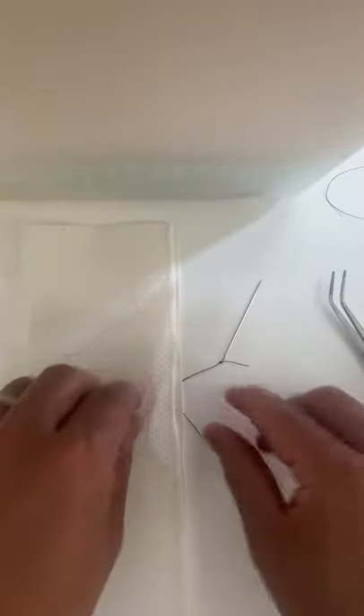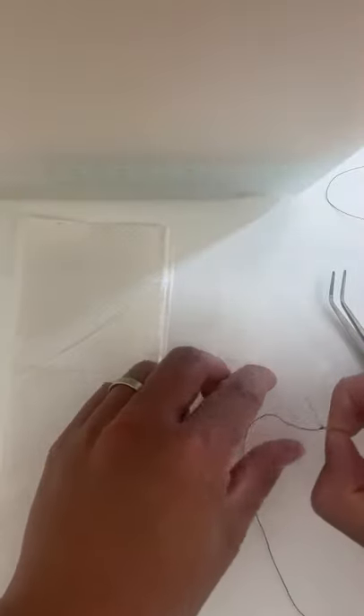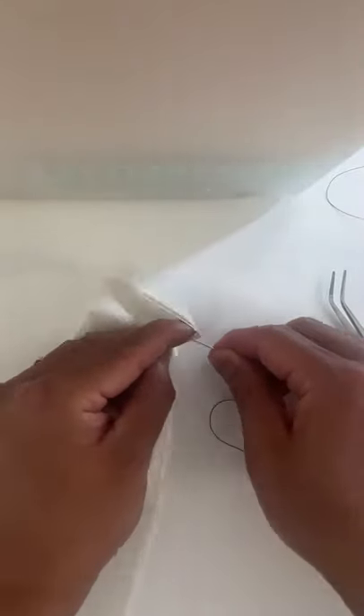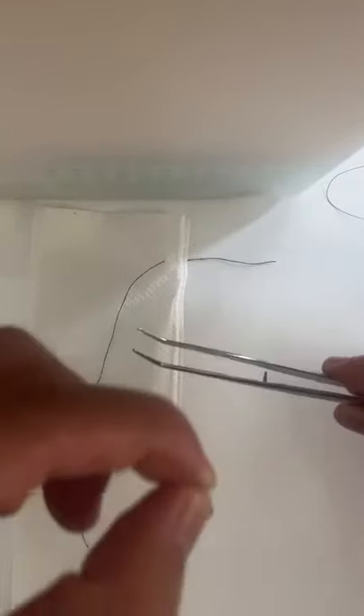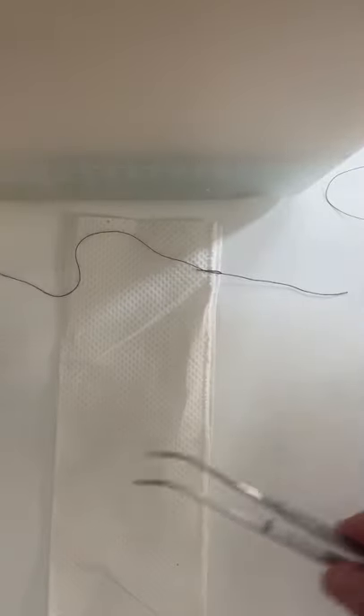So just fold it in half and we're going to connect it together. We're going to begin with the same exact technique as we did for the interrupted single suture here. We're going to start by going through both ends of the tissue. We're just going to leave a little bit of slack here and then we're going to do four wraps — twice, once, twice. Then we're going to grab the back end of our thread and pull through.